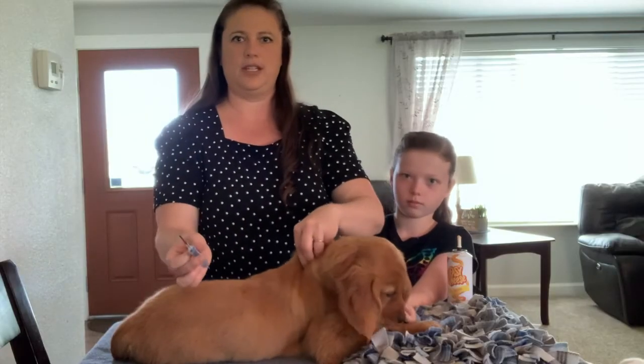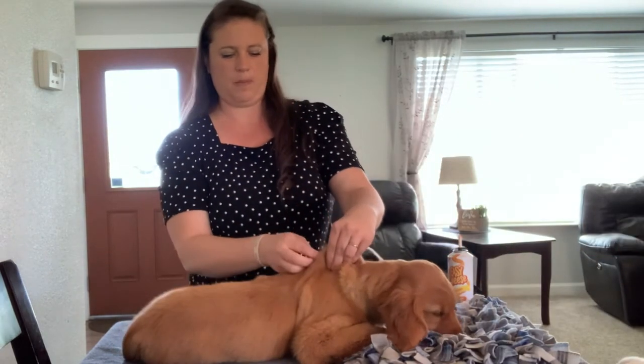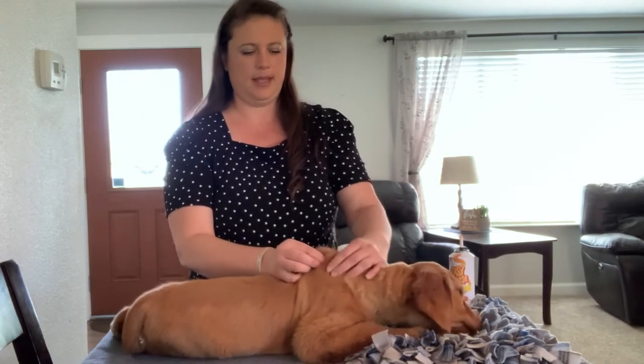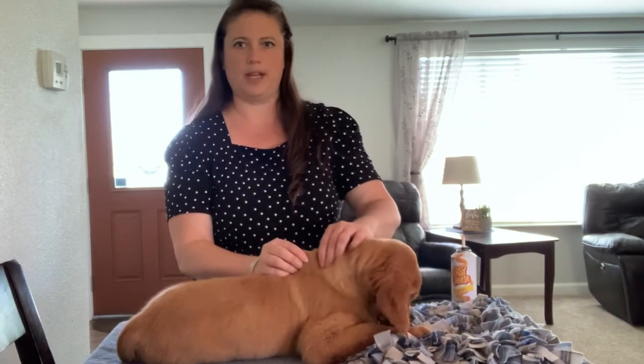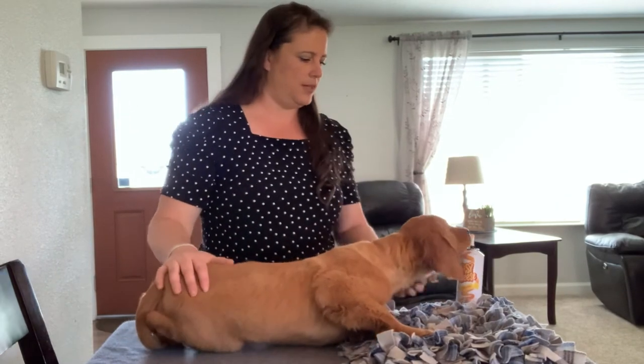We push it all the way in, push the microchip in, pinch the skin, and pull it out — and she didn't even cry. We hold the skin when coming back out to make sure the microchip stays in the skin. And I can actually feel the little microchip right here in her neck.